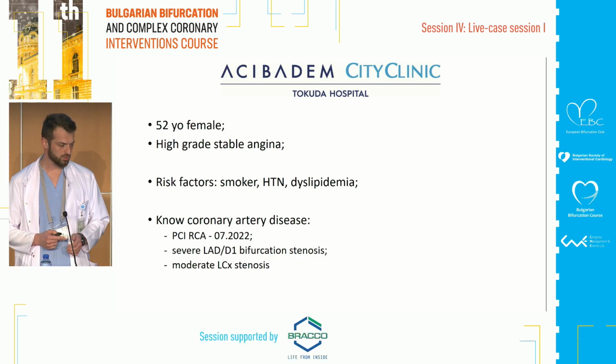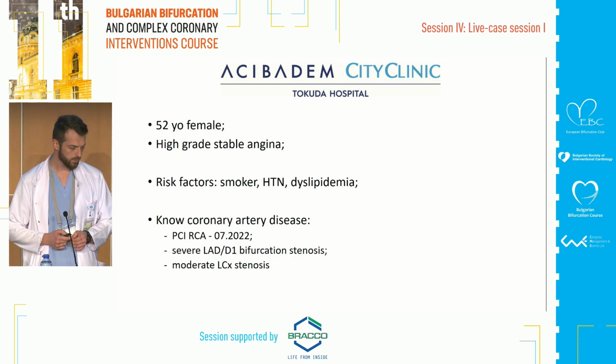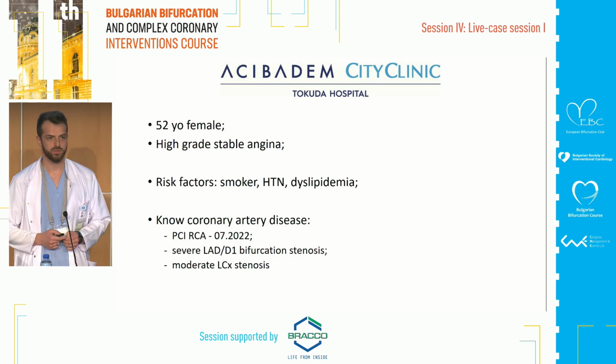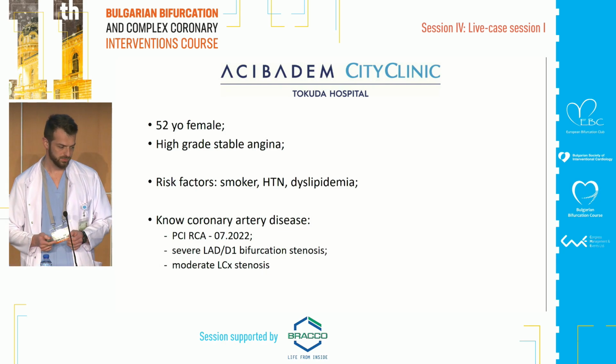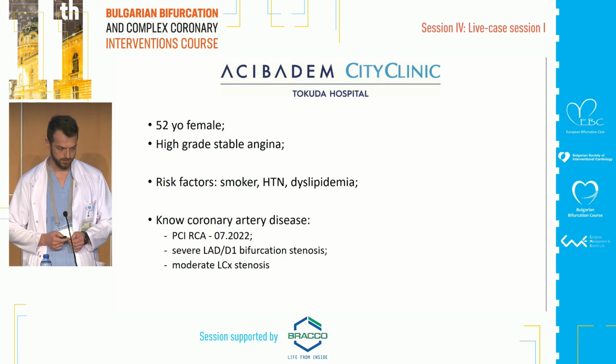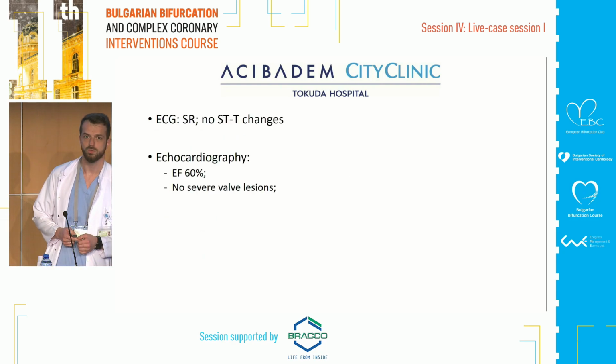She has known coronary artery disease, and half a year ago, PCI of the right coronary was performed. Also, severe LAD bifurcation stenosis and moderate left circumflex stenosis were observed, and she came to our clinic. She has no ST-T changes and has a normal echo.